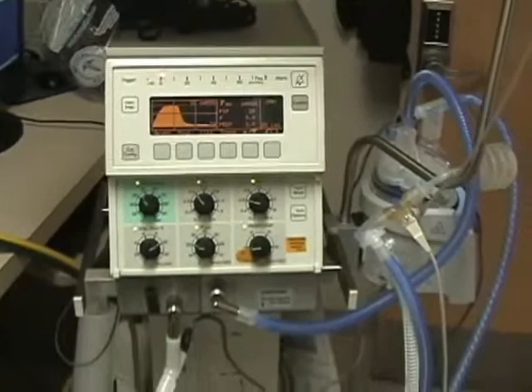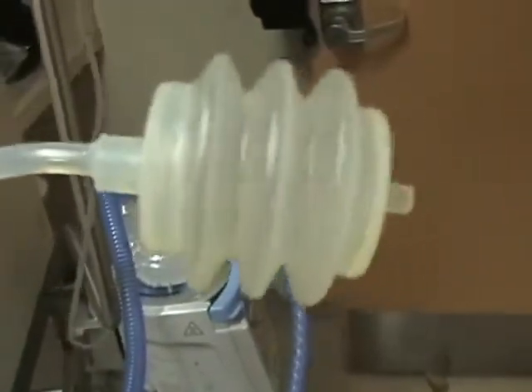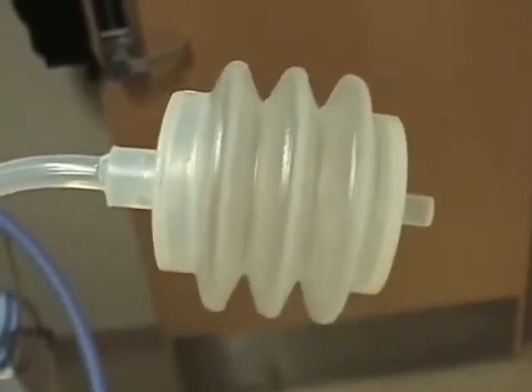Need a Draeger baby log. Draeger screen. We'll get back to it in a little bit. Ventilator circuit. Test load. Notice the difference compared to the oscillator.